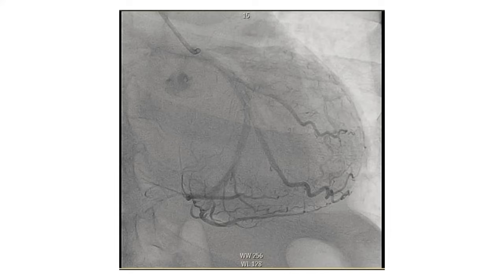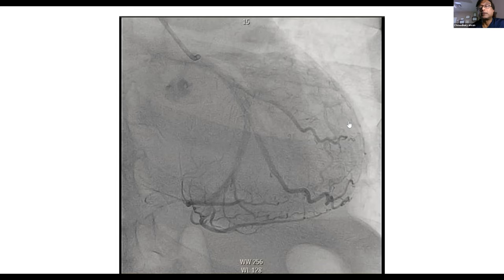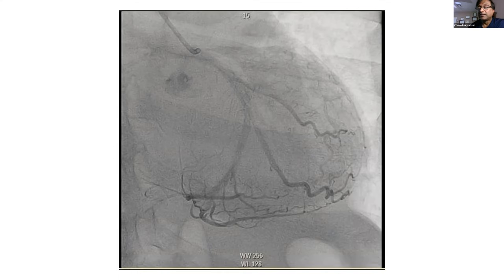So what is the calculated EF, Hafiz? Well, the calculation is an eyeball calculation, but the EF is semi-quantitative, about 20%. Yeah, okay. And then there was a pleural effusion.